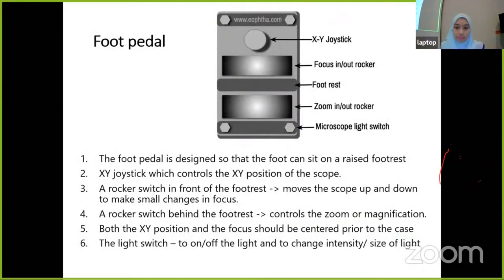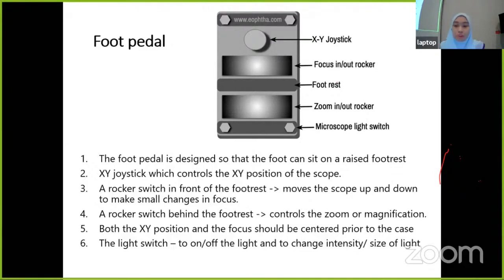The foot pedal is used with the left foot at the footrest. We have the XY joystick, which controls the XY position of the scope. The rocker switch in front of the footrest moves the scope up and down to make small changes in focus. The rocker switch behind the footrest controls the zoom — to zoom in and zoom out. Finally, there is a light switch to turn the light on and off and also to change the intensity and size of the light.